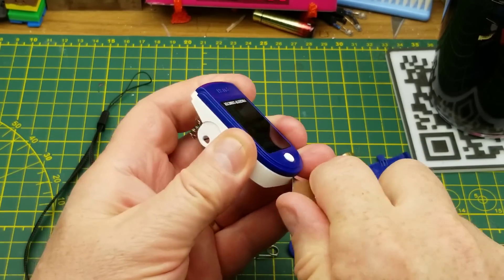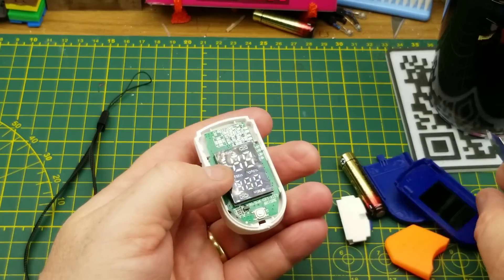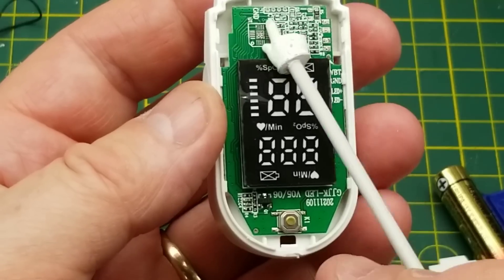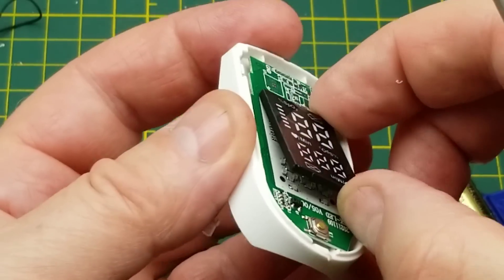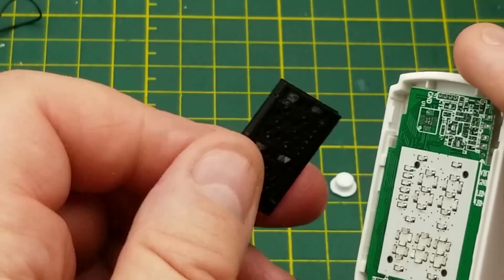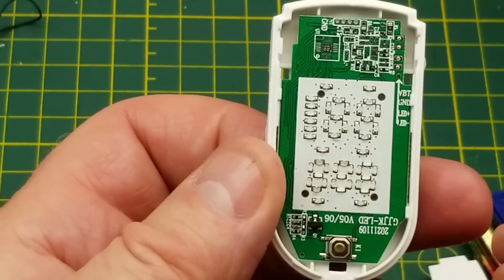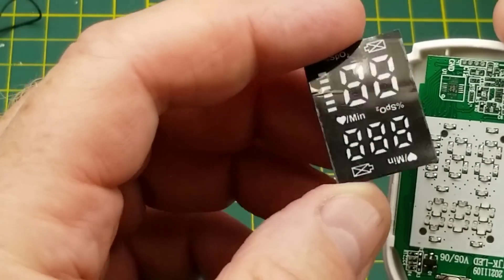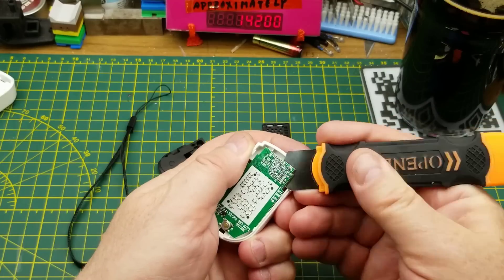We'll try getting in from the top - and that was easy, almost too easy. There's a little tactile switch push button and a transistor of some sort, with no other components on this side except for the display. That display is just a lens with light guides in it, and there is an array of LEDs. So they didn't have to make a custom LED display - they just made a custom little bezel with a transparent print. That's pretty cool.